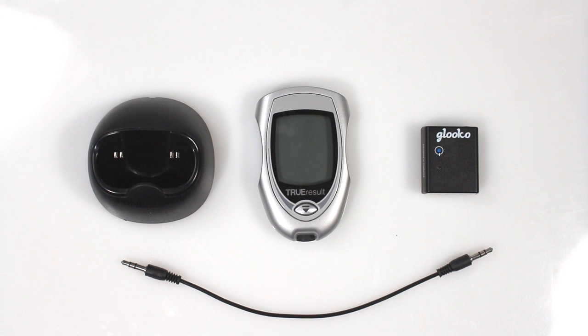Hello and welcome to Glooko. In this tutorial we're going to show you how to download your meter to your mobile device with a Glooko MeterSync Blue. By now you should have already paired your Glooko MeterSync Blue with your mobile device. If you have not yet paired it, please pair your Meter Sync Blue from the settings screen in the Glooko app.